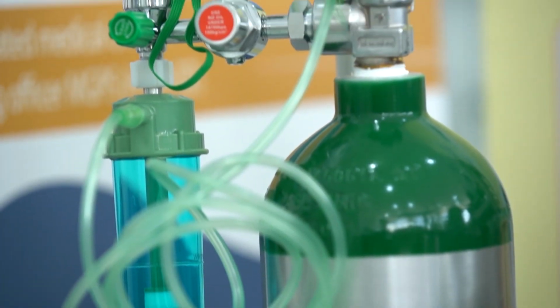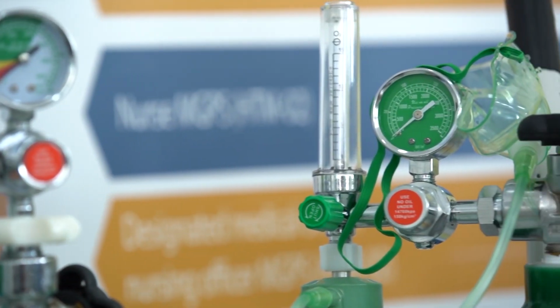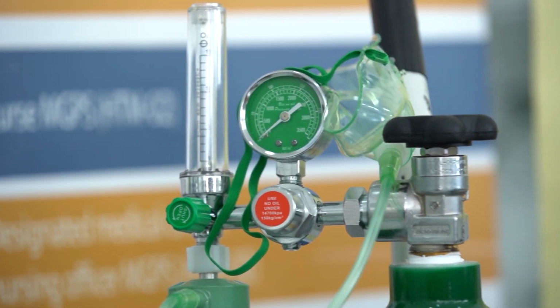But all these machines and equipment are calibrated to certain pressure and flow. Therefore, each and every regulator, flow meter, nebulizer or humidifier is calibrated according to the requirement of the patient.